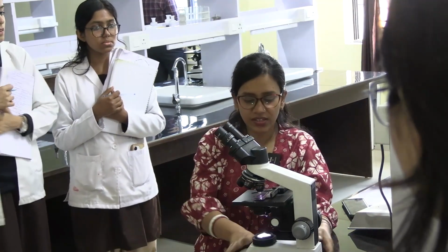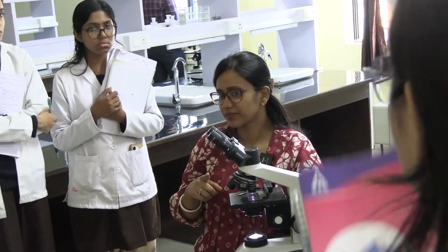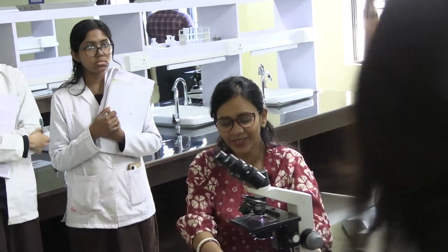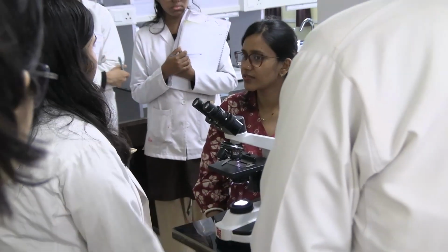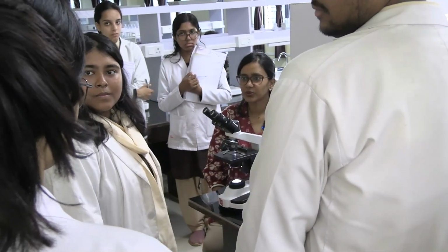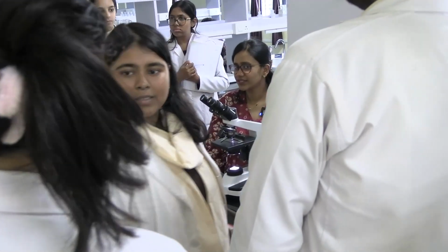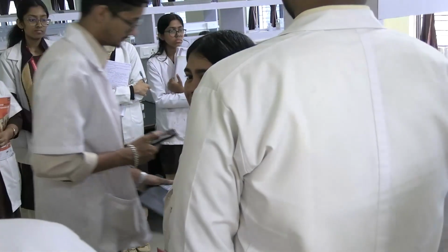So you can start seeing. I focus this area. Who will start? Somebody start seeing the slide. Come. Who's good with taking pictures from microscope? Nobody? It'll be easier for you only. Click the picture.